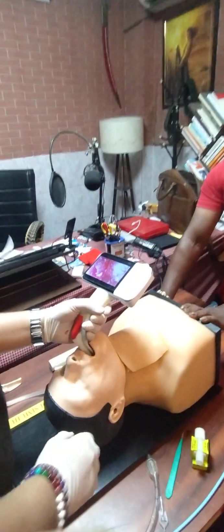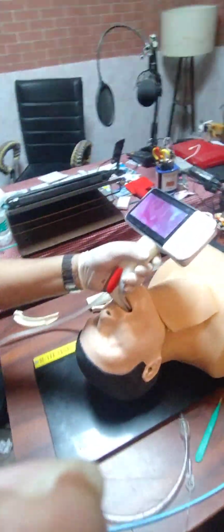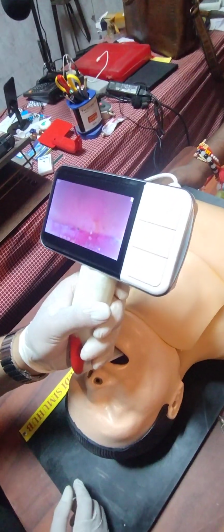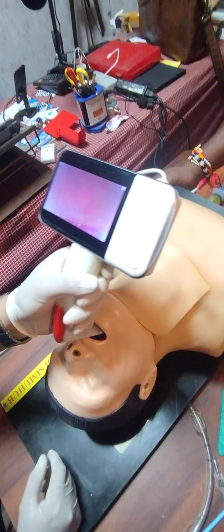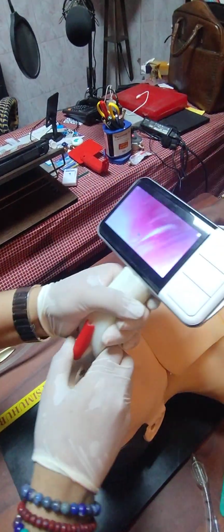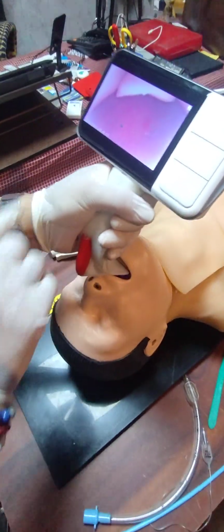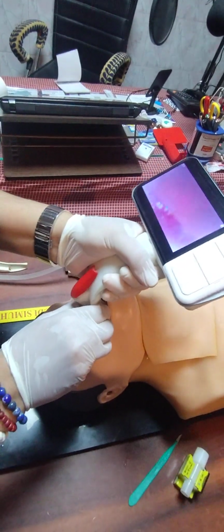So one must be comfortable when doing intubation. So uvula leads to epiglottis. Okay, so first you introduce the VL, then look inside the oral cavity, then look at the screen. Okay, so I'm not seeing anything here, and then manipulate. Because it's difficult intubation, we'll have some manipulation. Now I can see the epiglottis. Okay, tube. So now I have a little bit of maneuvering.